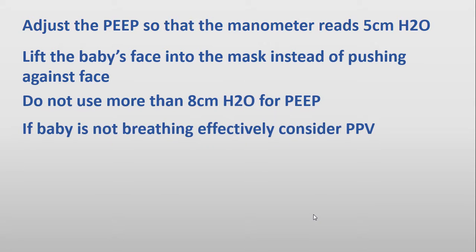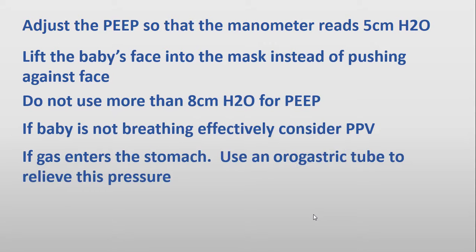And if the baby is not breathing effectively, we need to always consider the use of PPV. And we will review the use of orogastric tube to relieve the pressure if gas enters the stomach. So let's look at a couple of videos.